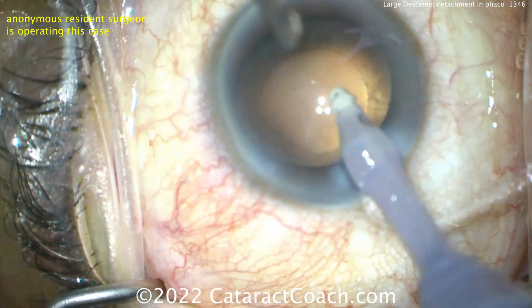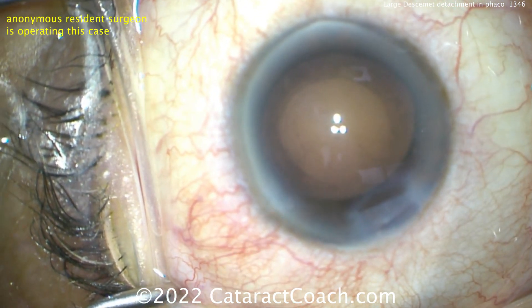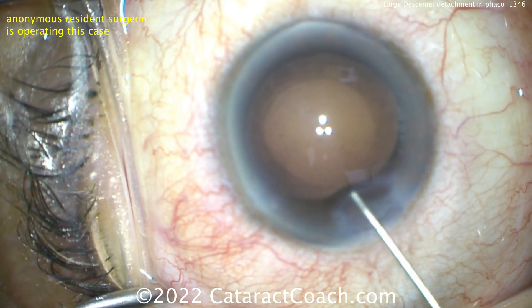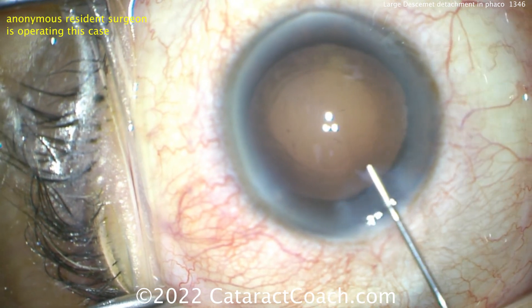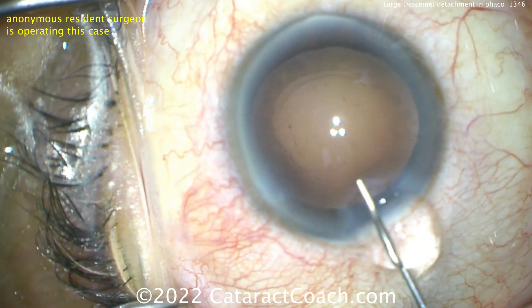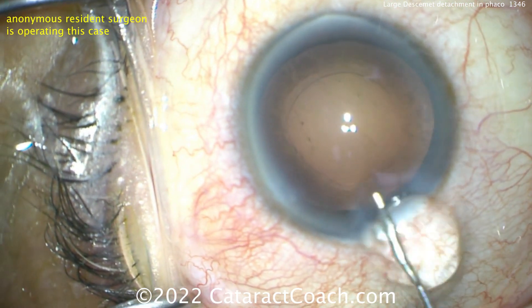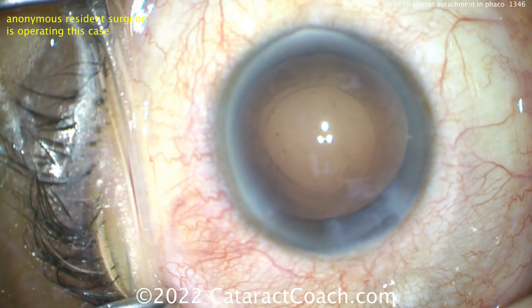Here's cortex removal — it looks pretty good. A nice capsular bag is going to be inflated now with viscoelastic. There's no Descemet's detachment now; everything looks fine. Filling up the capsular bag and deepening the AC as well. Looks like cohesive viscoelastic — very reasonable. Getting it in that bag.